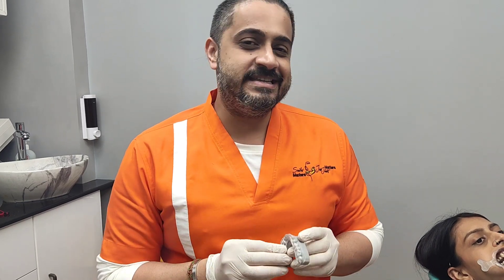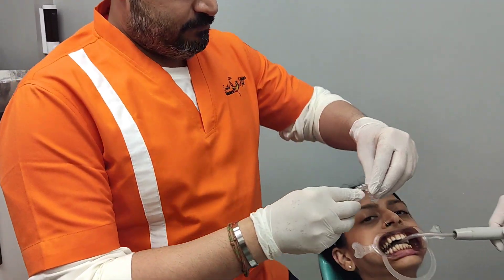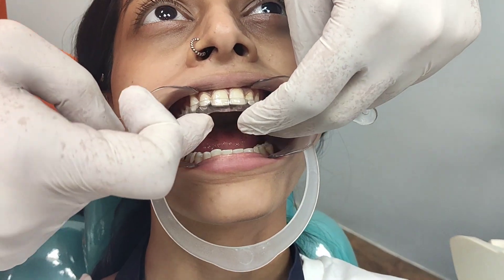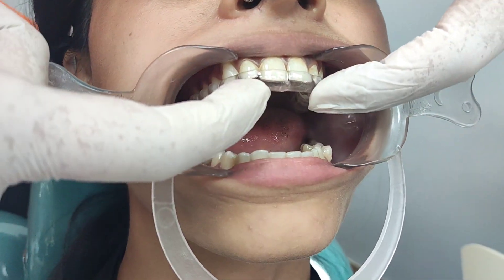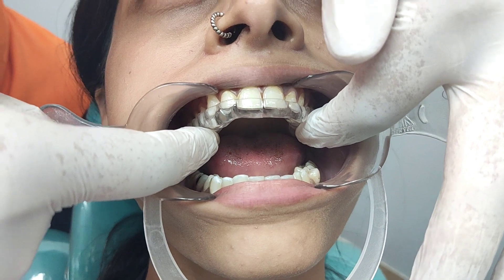Let's go ahead and test this CAD CAM splint for our patient who has anterior disc displacement with reduction. We take the splint into her mouth — see how beautifully it fits in position, is extremely retentive and stable, and has absolutely no rocking.